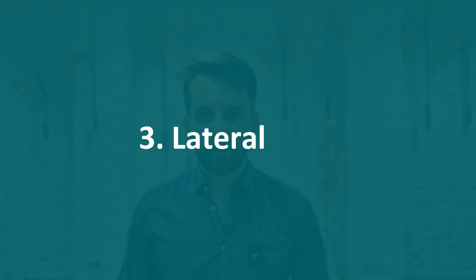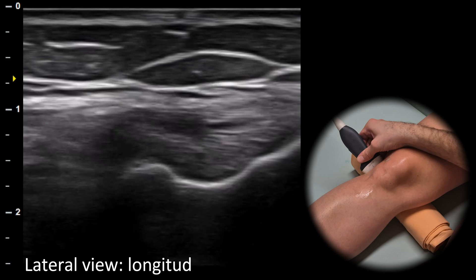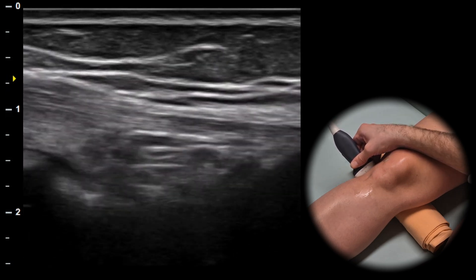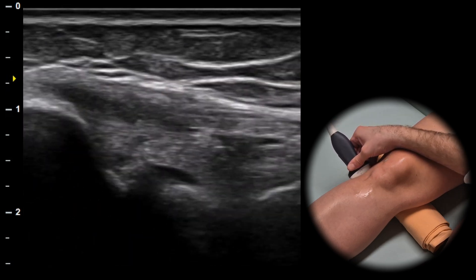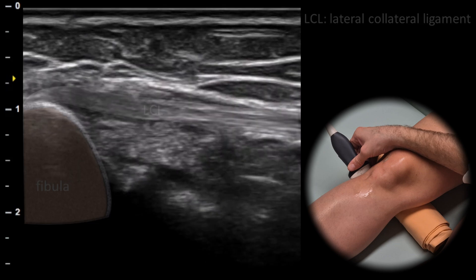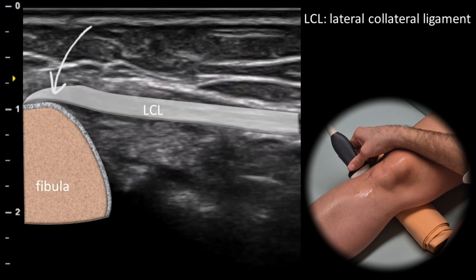The next view is the lateral view. In the longitudinal plane we can identify the lateral collateral ligament, which extends from the lateral condyle of the femur to the head of the fibula.